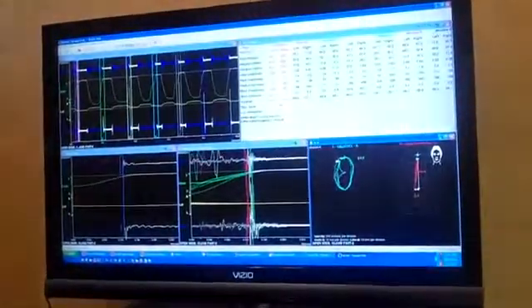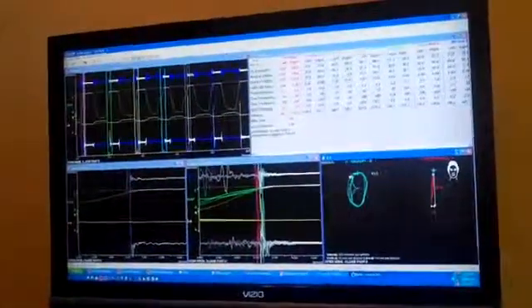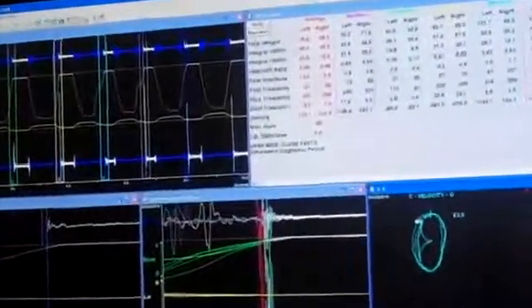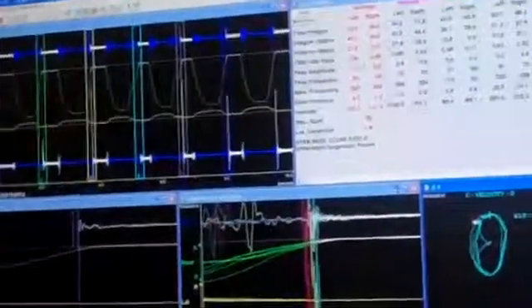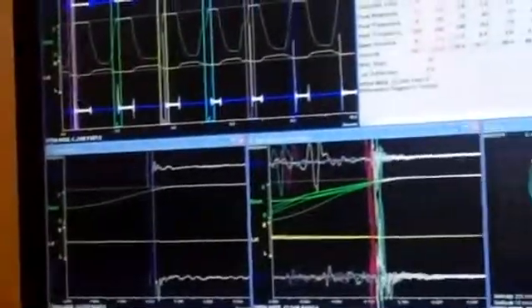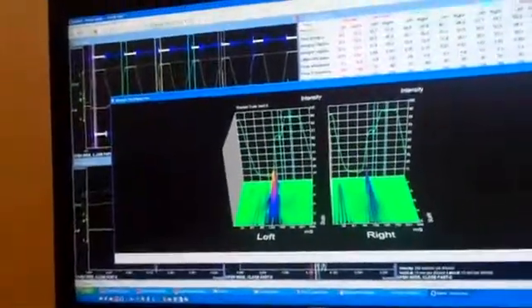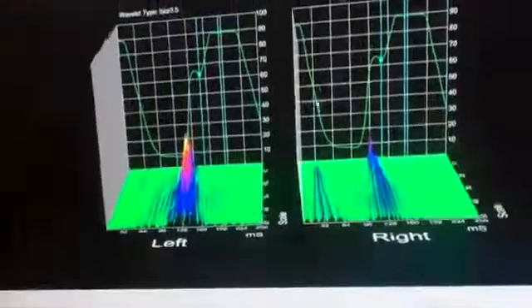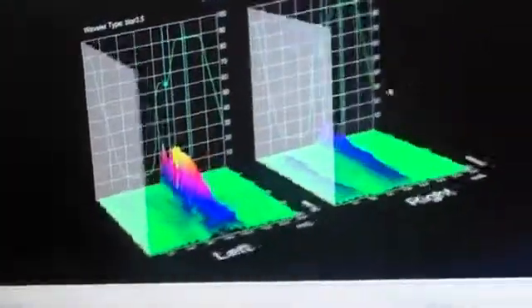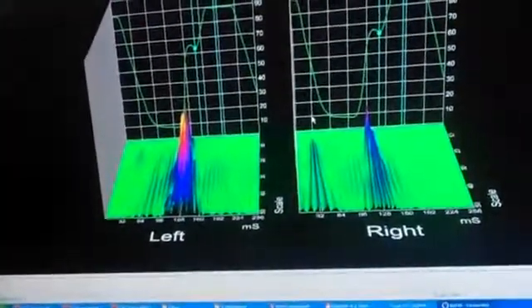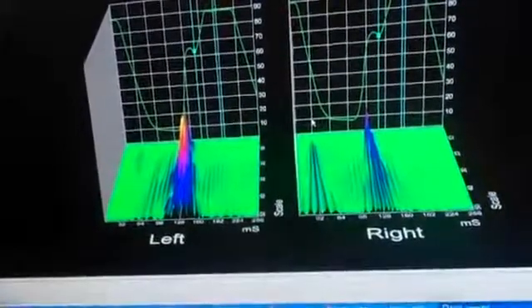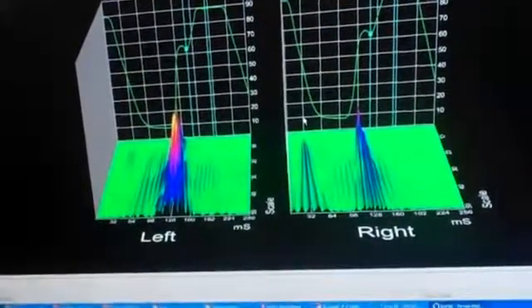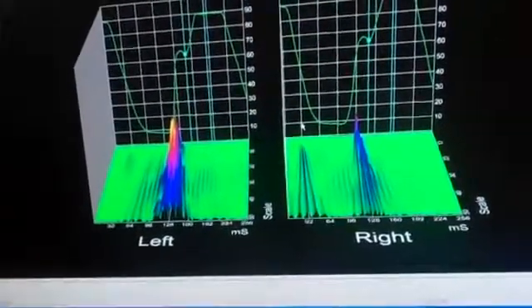That tells us there is a problem in that particular joint. As we can see, the patient actually has discs in both joints that are loose, but it's also the fact that the discs are a little bit torn. We can look at this in a three-dimensional waveform pattern. As I indicated earlier, that's the kind of energy being spent to compensate for that joint problem. Now we can predict, looking at the joint, the bite, and the muscles, what's happening with the patient without having to do any guesswork.